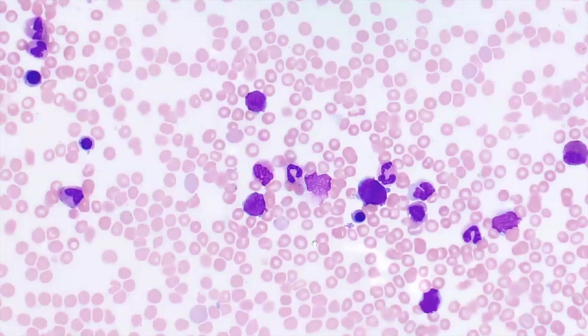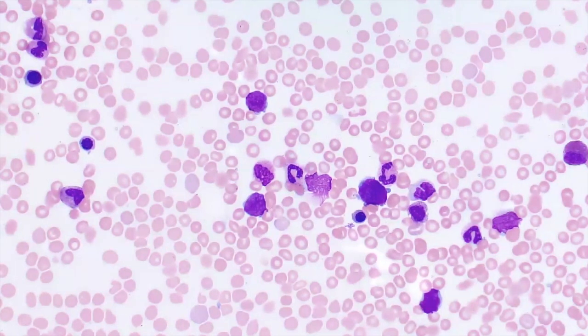If blasts show characteristic blebbing as seen in these 3 blasts, this may suggest a megakaryoblast lineage and can be seen with acute myeloid leukemias with translocation 1;22. This type of AML occurs most commonly in infants without trisomy 21.